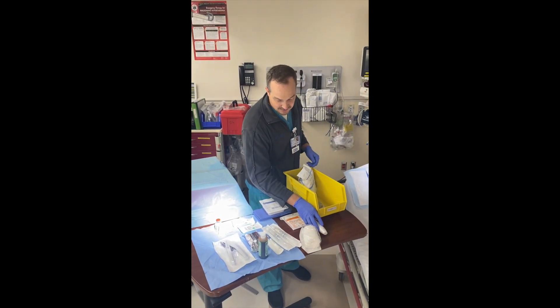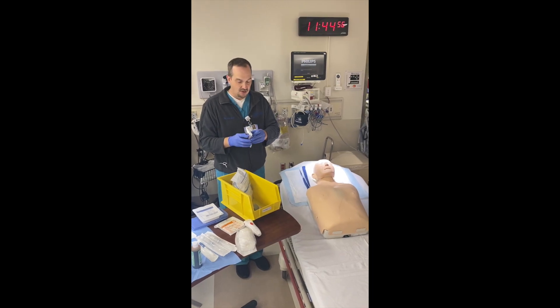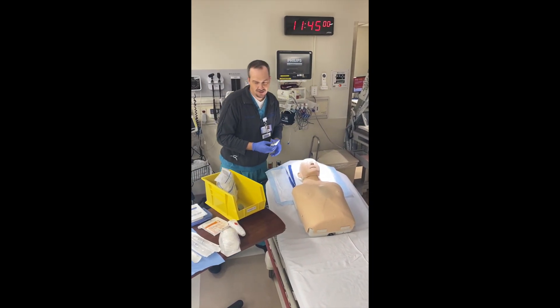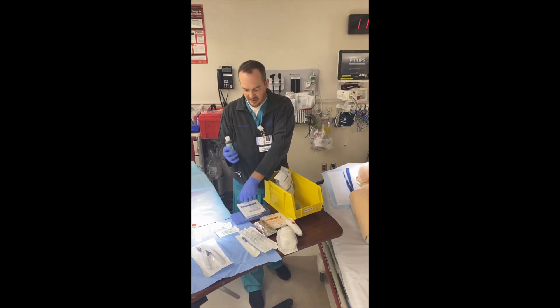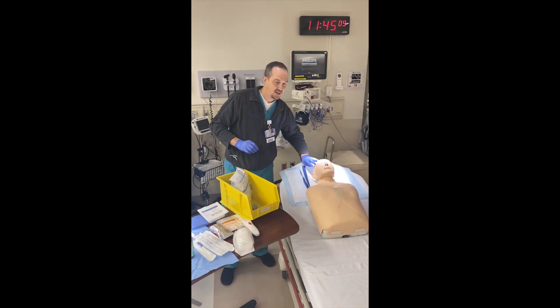The next step: sometimes I'll start with a scrub brush and get some sterile water to scrub the hair and get it away, especially if someone has long hair. Another option is betadine or a chloraprep stick — pour this on the gauze, and after it's shaved, clean it and wipe it away.